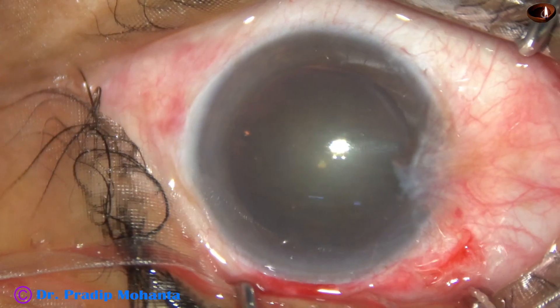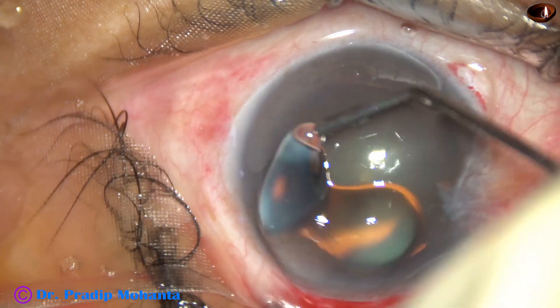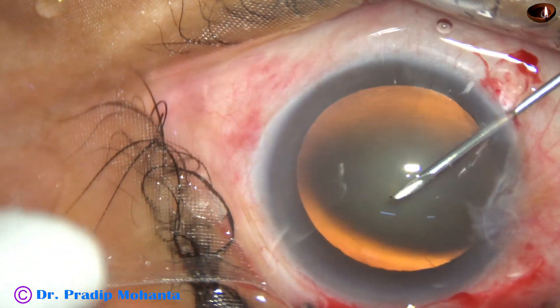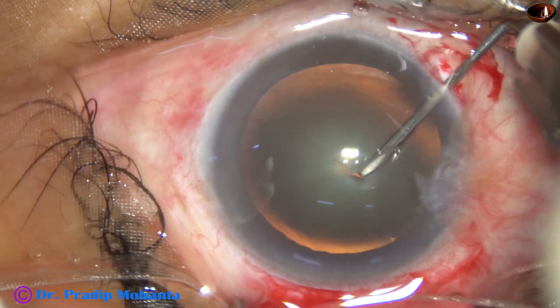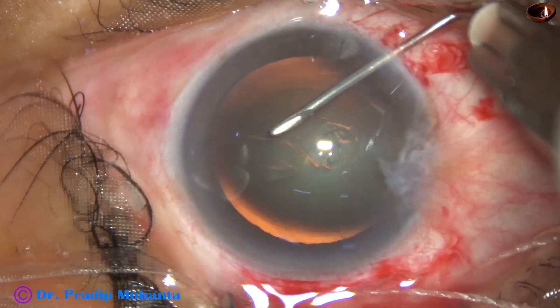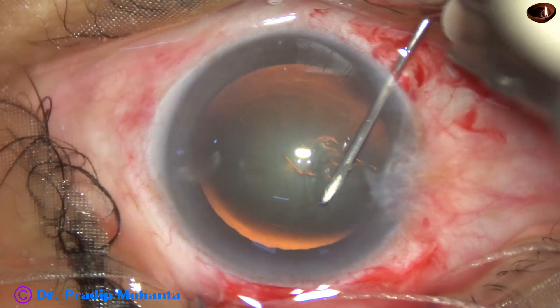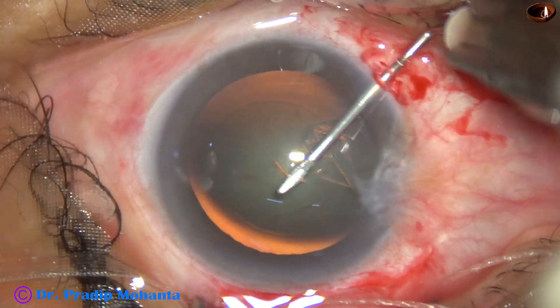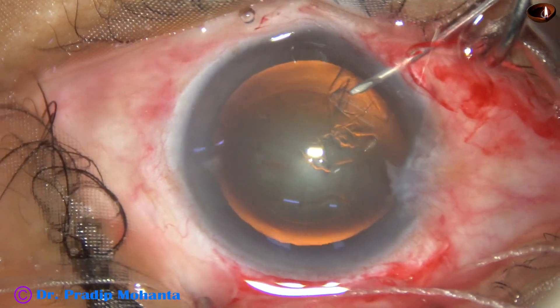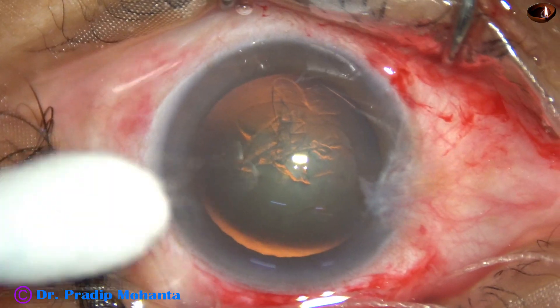This is a side port on the right side at around 7 o'clock. The anterior chamber is filled up with visco, and visco is applied over the corneal epithelium. Now this is rhexis with the help of a needle. The rhexis should be about 5.5 to 6 millimeters in a SICS. If the nucleus is hard, it should be 6 to 7 millimeters.